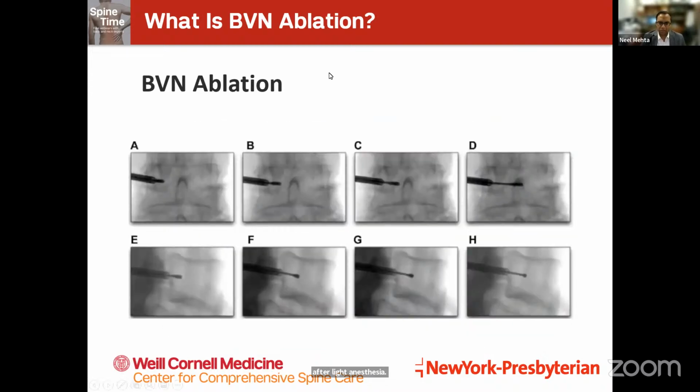Here, the next image is, I think, Dr. Pak, your slides. Just talk to us about what's happening here. Yeah. So these are what we would see as the practitioner when we're actually doing the procedure itself. We keep talking about the access point. How do you get into the bone? What we're looking at here is specifically the pedicle, to get access into the vertebral body. This is showing it step by step. What you see here is an access cannula, and then what you see extending into the vertebral body, which looks almost like a probe, is what actually conducts the lesioning.